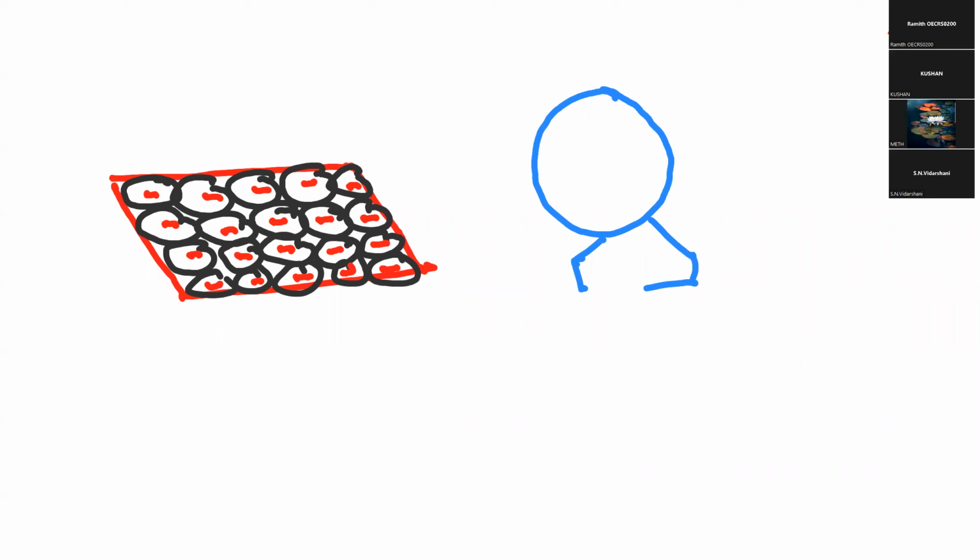Right? In the galvanometer, there are two electrodes, positive and negative. Here there is a zero point. Let's think this is the negative electrode and this is the positive electrode.